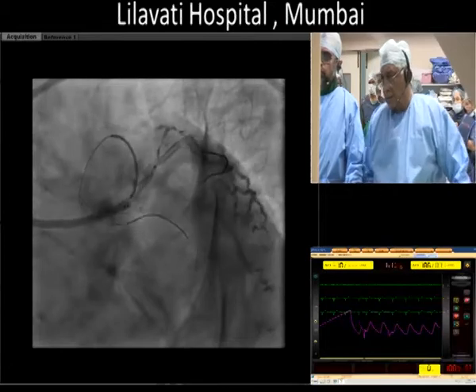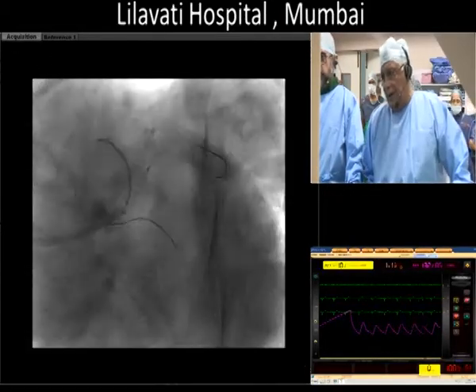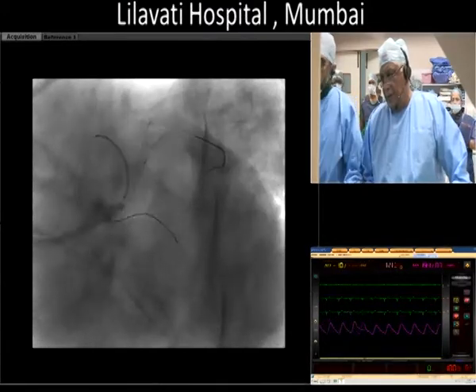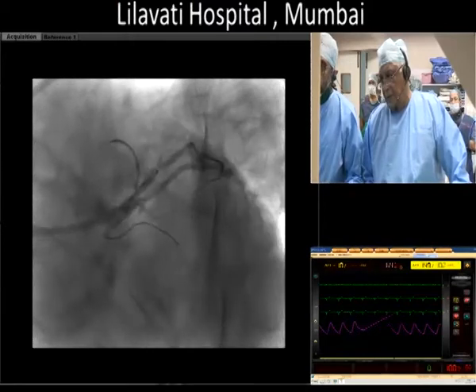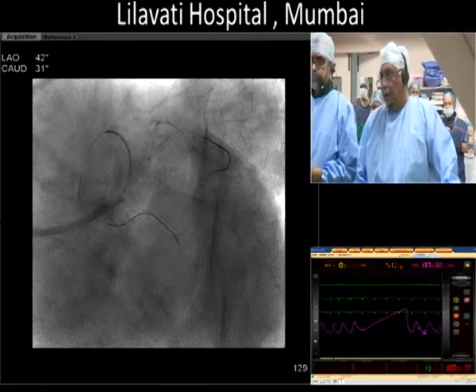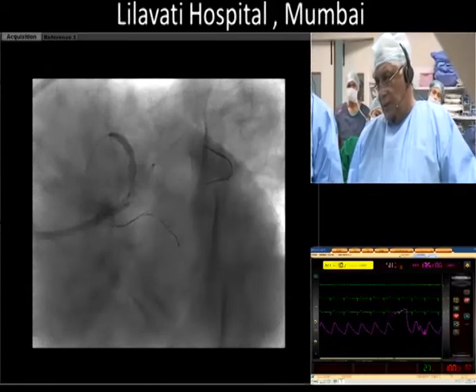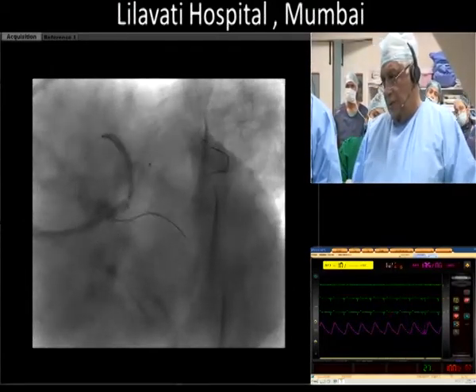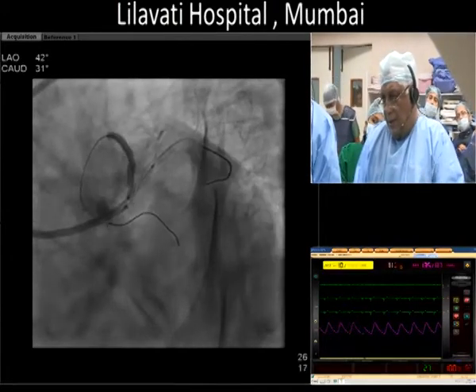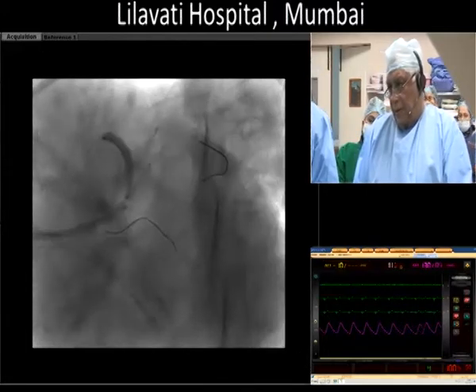I think that is pretty good. Protruding a little bit, a little bit inside the left main. Okay, this way. Go. You saw I have kept the diagonal balloon out. So this is interesting. You're trapping the diagonal balloon.